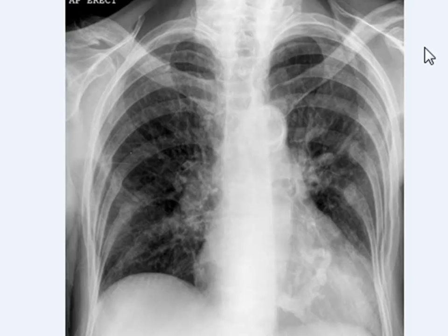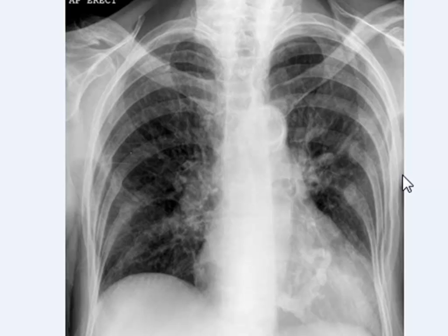It is also known as the minor fissure, which separates the right upper lobe and the right middle lobe. There is no middle lobe on the left side, so there is no left horizontal fissure. This is made up of a double layer of visceral pleura, and it separates the right upper lobe and right middle lobe.